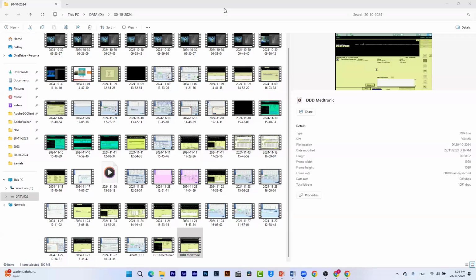So I will go for an EP study to show the retrograde conduction. There are a lot of things to do by EP study. In pacemaker, I give you an example of three scenarios. You can use an EP study in a patient with a pacemaker.